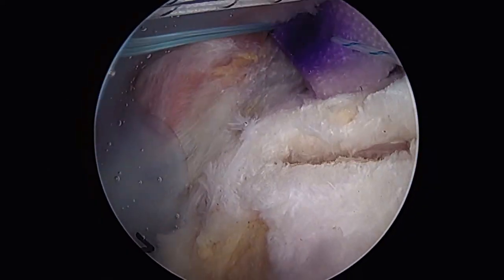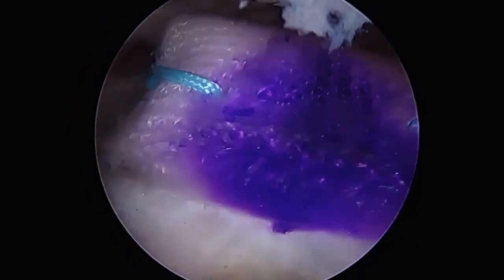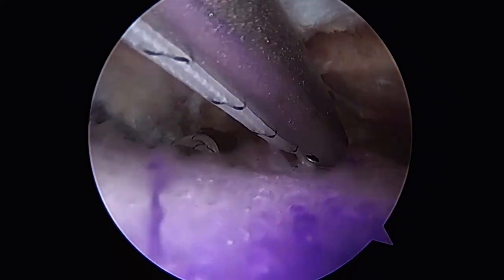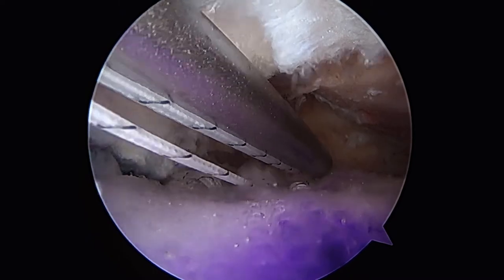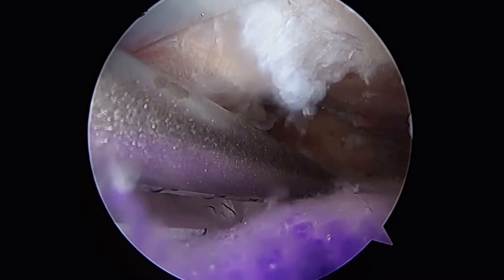We'll move the lateral sutures outside of the lateral cannula to allow better access to the graft and continue tying medially. We prefer to tie these sutures medially to take advantage of the strength of the graft and fix the graft directly to the cuff with sutures.